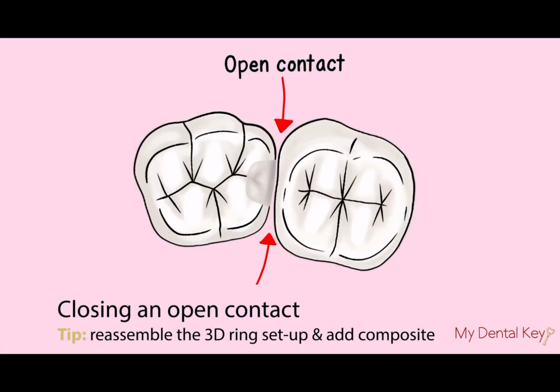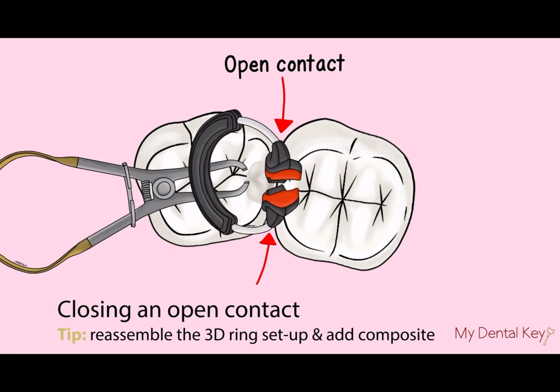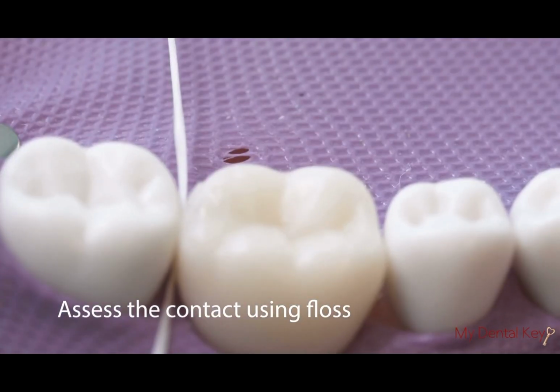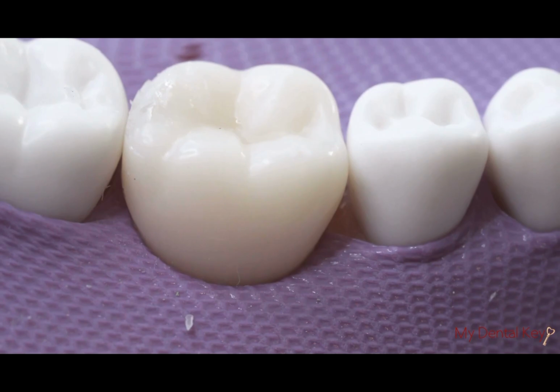In the event that your contact is open, don't panic. First, remove a small amount of additional composite from the contact area using your rotary instruments. Then, reassemble your sectional matrix setup and 3D ring with a new sectional matrix band and add composite to the contact area, carefully compacting and recreating the marginal ridge anatomy. After removing interproximal excess, opening a tight contact or closing an open contact, check the contact area again with floss.